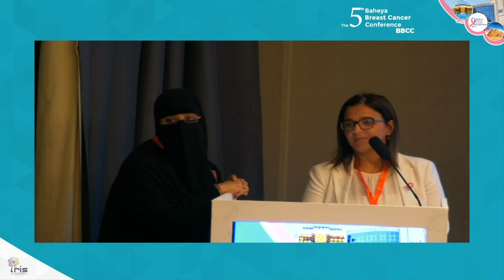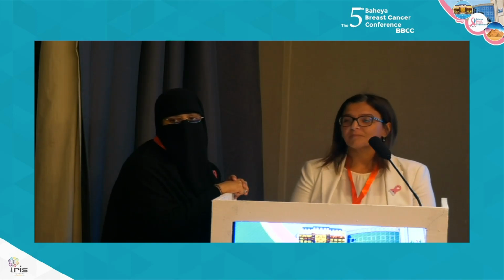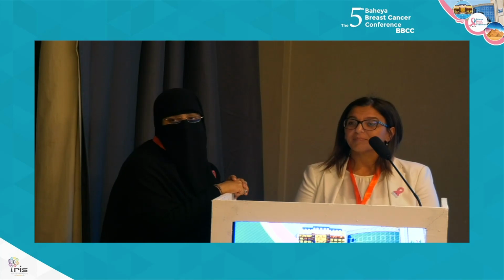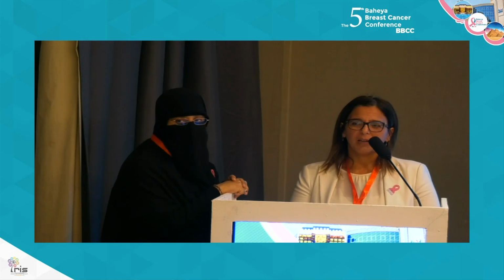Yeah, thank you. Fantastic cases. Just on the last one, did you do E-cadherin to exclude lobular neoplasia? It just looked very monotonous, a bit discohesive. It did not look discohesive to us. Maybe the pictures, or I don't know, but we did not have that suspicion. Right. It's just generally to be on the safe side if you have a fully solid proliferation. Particularly it looked like it has some pagetoid spread as well, with some residual positive.